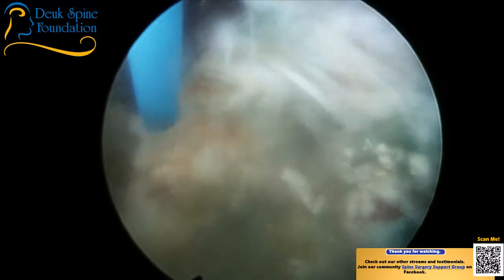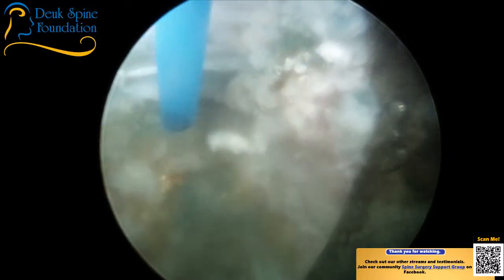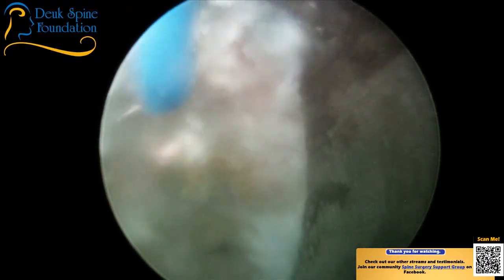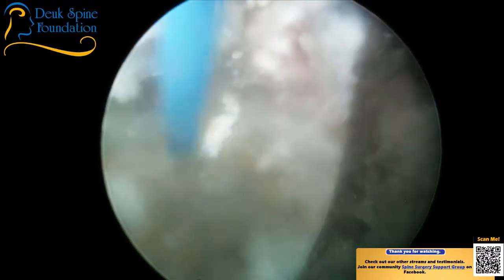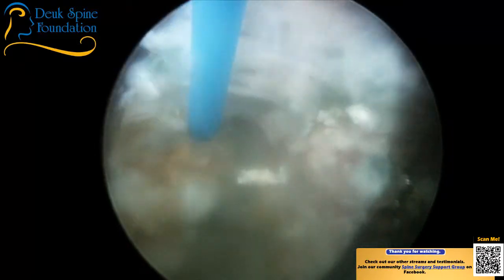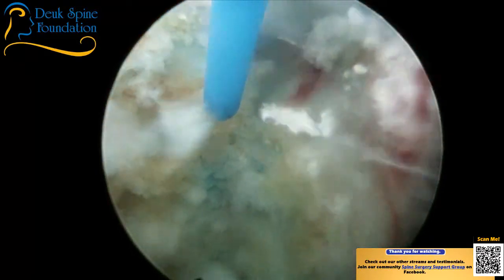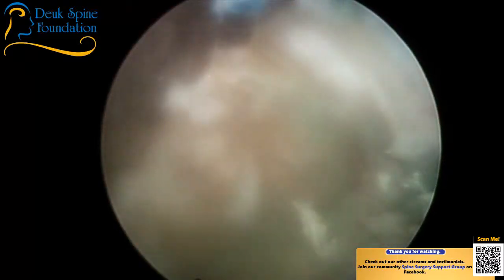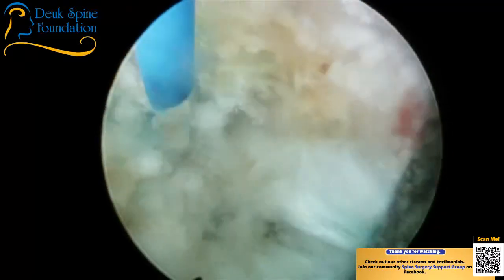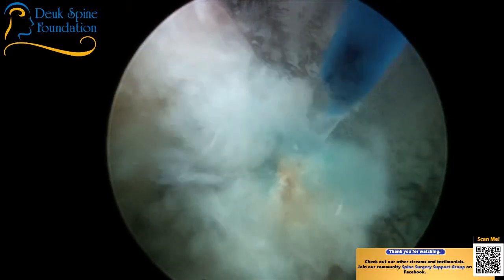Why do I use a laser? Because this laser, folks, the blue thing, has a diameter of 0.5 millimeter. Think about that. 0.5 millimeter. That's less than the space between your fingertips when we make a very small space so you can barely see the light. Okay? If that laser is 0.5 millimeter and it's working nicely in this little space we've got, what do you think is going to happen when I use something big, like big and metal? It's not going to fit in here.